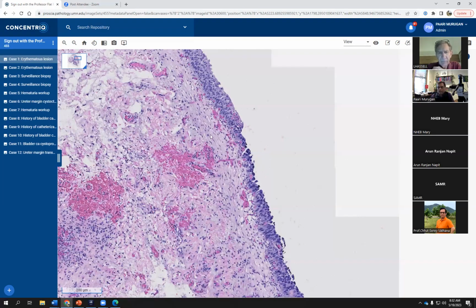So the same thing can happen in bladder carcinomas too. When there is P53 mutation, you can occasionally see a null pattern, which is what that case was. The important thing is to understand that this is also possible as a form of P53 mutation. You may not always see an intense staining of P53 in that situation. So that's a really good pickup. Thank you for highlighting that.